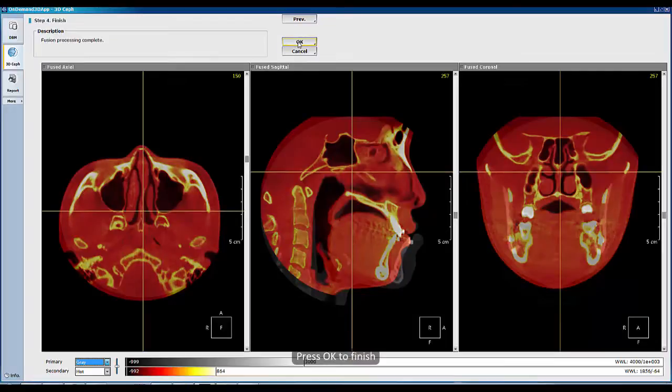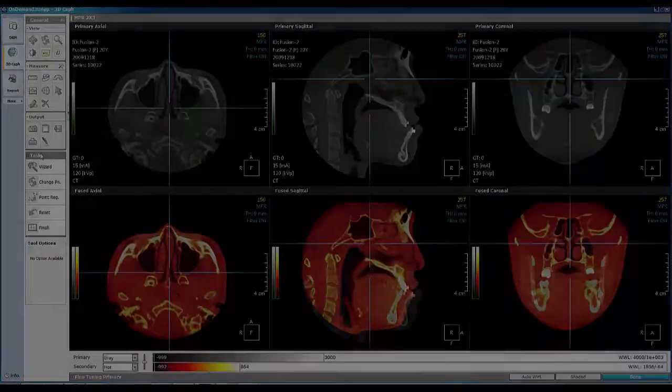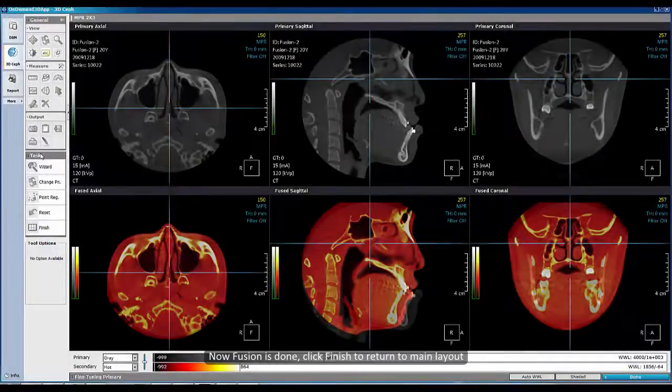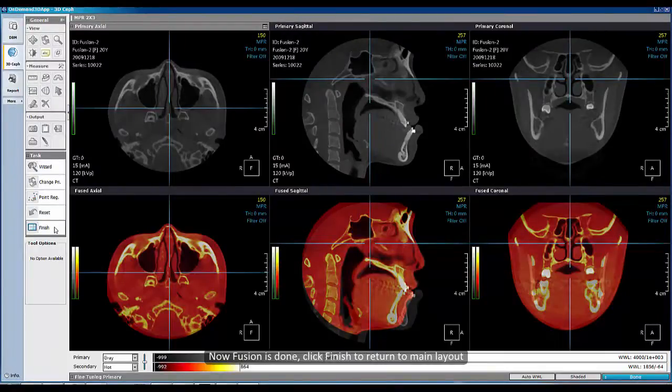Click Next to proceed with auto-registration, and press OK to finish. Now fusion is done — click Finish to return to the main layout.